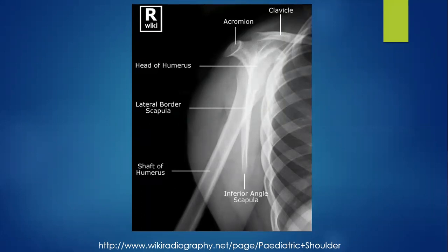So this is the only view that's going to tell the doctors which way they need to push that shoulder, or that humerus, to go back up into the space where it needs to be if it's dislocated. So a scapular Y view is pretty common. The Grashey view is another alternative we'll talk about tomorrow and in our lab.